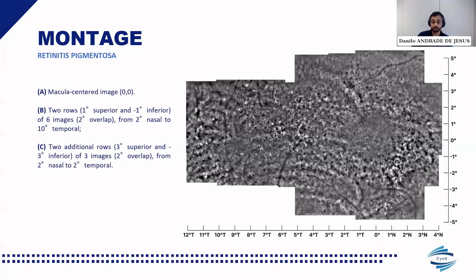Therefore, when we started the project, we also tried to reach other scientific researchers with vast experience in AO imaging, namely Dr. Kyoko Gocho from the Kansai Hospital and Dr. Daniel Rochendale from the Lions Eye Institute in Australia, whom I would like to thank for their contribution to this project as well. After several interactions, together we came up with what we think is a suitable protocol for imaging IRDs, in this specific case, retinitis pigmentosa.